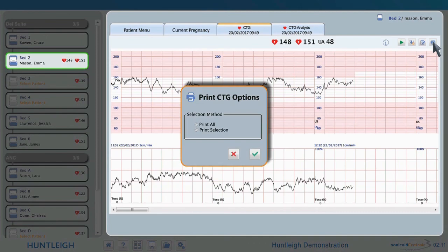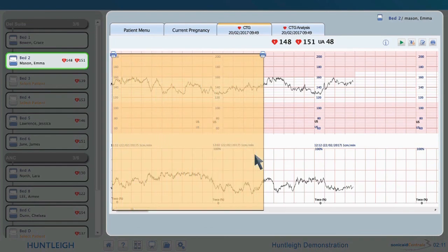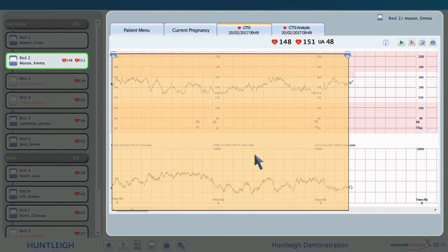To print out the trace, click the printer icon. Select print all for the entire trace, or print selection for a smaller part of the trace. Here we will print a selection of the trace. Any printer connected to the system can be used. Move the print selection tool to highlight the section of the trace that is to be printed, and select the printer when prompted.